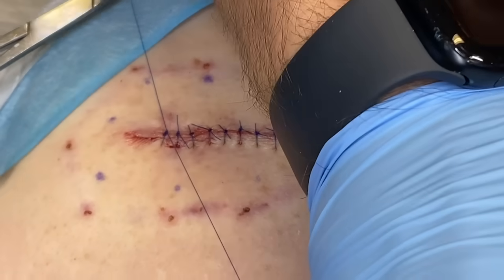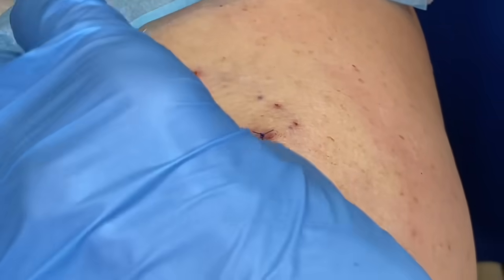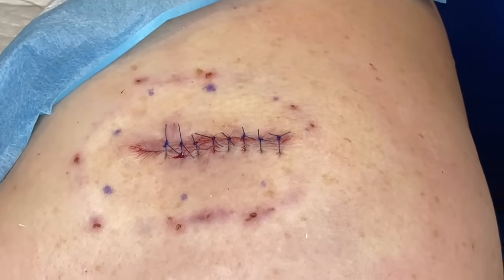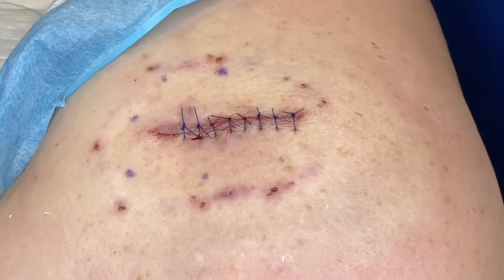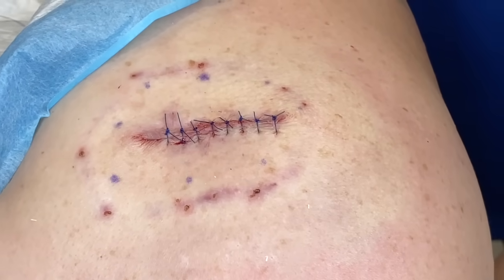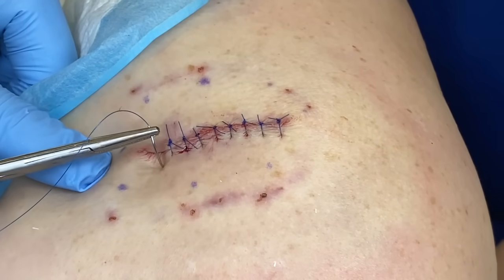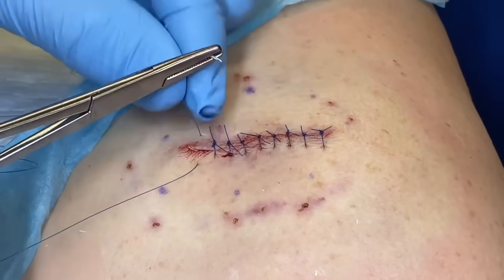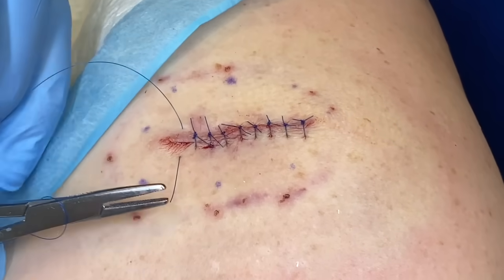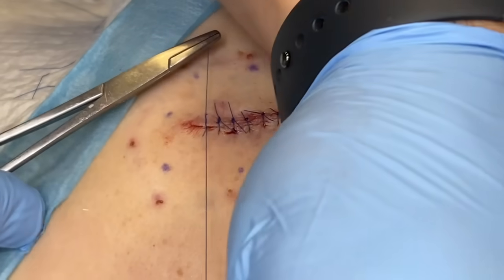But if this was your office, just starting, then you just want to be efficient with the thread. You do 1 stitch per cartridge. Just make sure you triple click, or else it'll slip on you. Lying flat. Nice.